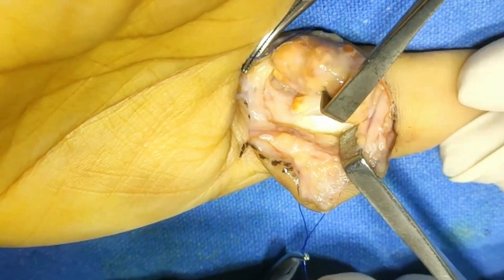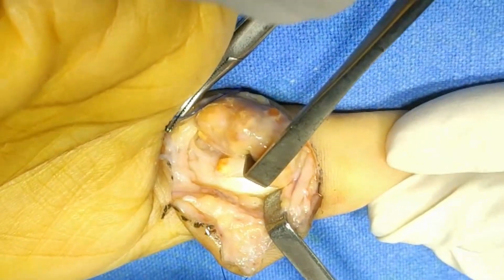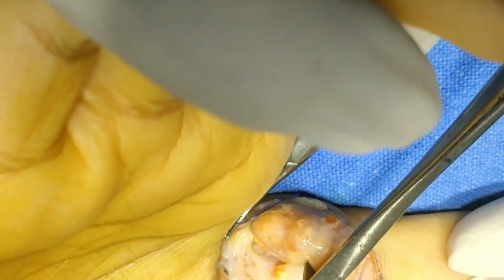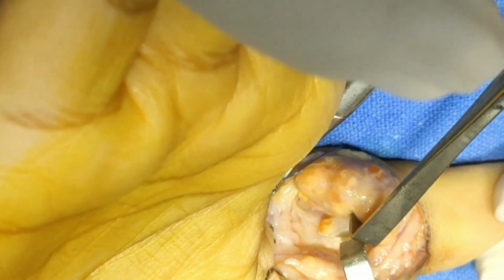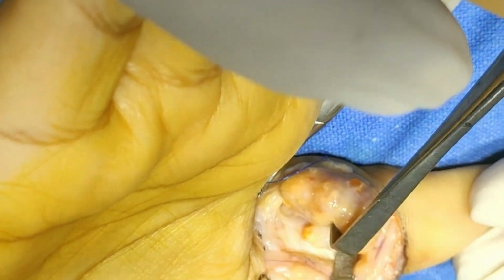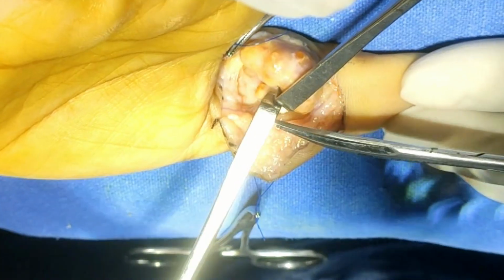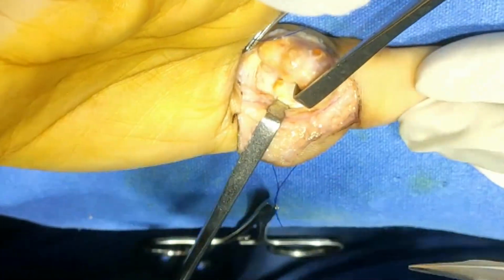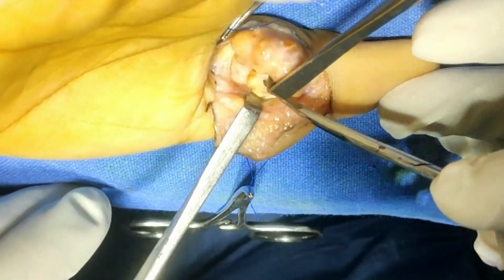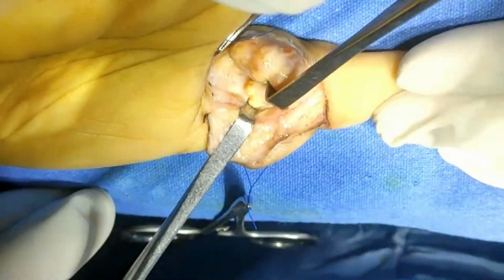Now we will separate this tissue. Here you can notice that the tissue is going deeper to the flexor tendons. Alright. So now excise the sheath of this tendon also. Now I am retracting this tendon here. Now to cut this sheath, this pulley, let it go in the proximal part, and then see it is there. It is quite deep. Now just retract. Now working in the deeper plane.